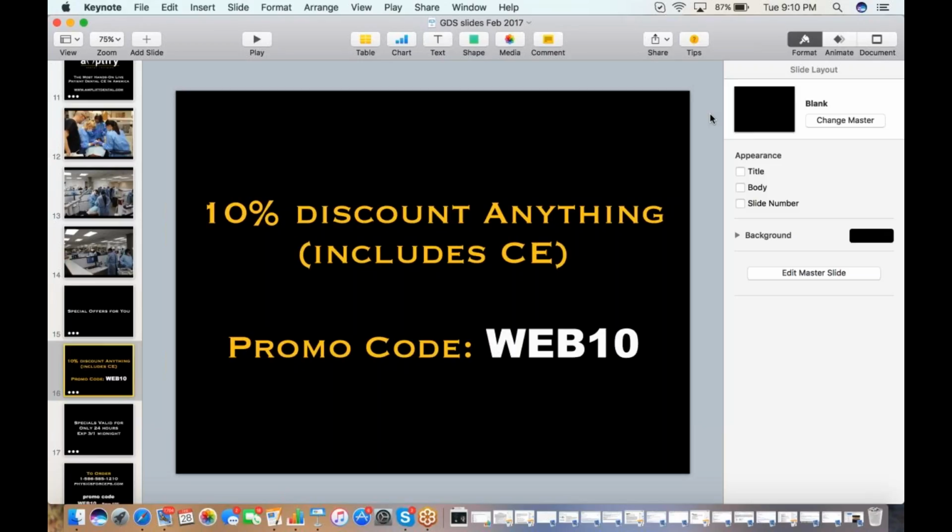Okay, perfect. There was another question that came in about the timing for the clotting. Some people asked whether there were any concerns with having to prep the extracted tooth for the dentin graft, which could take 13 to 15 minutes or so while the patient's waiting. Maybe you already covered this, where you clarified that the staff can be preparing the tooth and using the Smart Dentin Grinder while you're leveling the bone or doing other procedures. Is that not really a concern in your experience with the product?